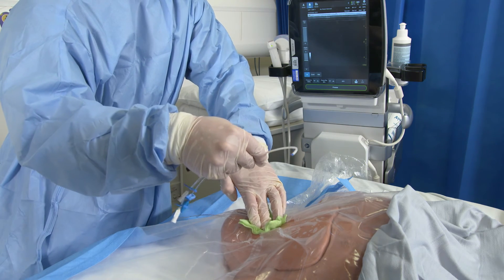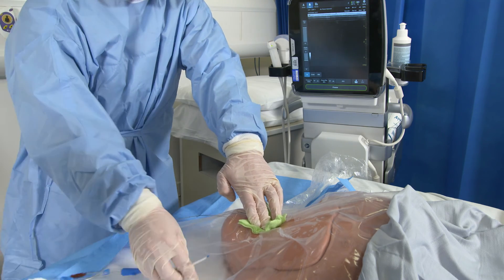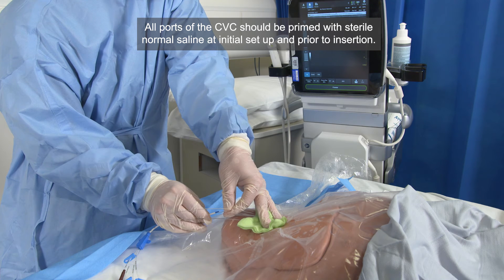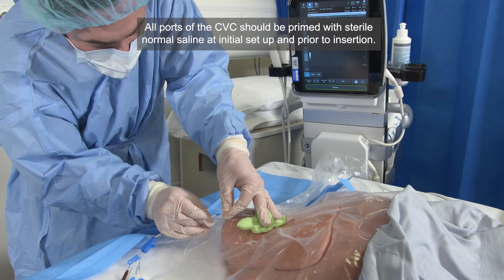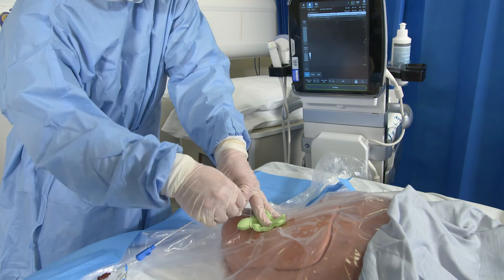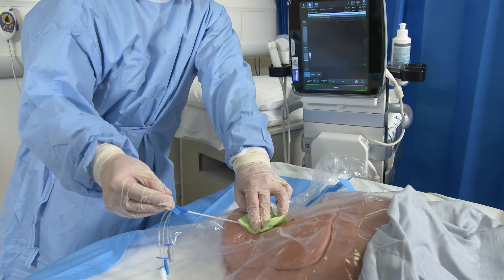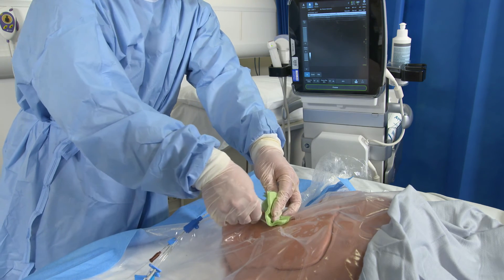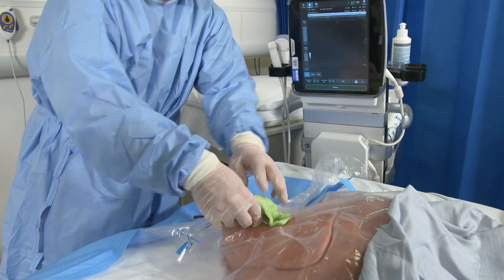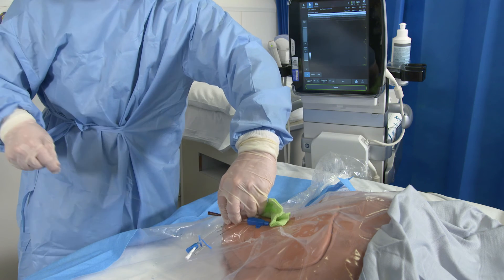Once this is done, you're ready to insert your line over the wire. Ensure that the longest lumen is unclamped and, using a similar technique to previous, insert the line over the guide wire. Ensure that the guide wire is free out of the line. Advance the line into the vein and finally remove the guide wire and clamp the lumen.